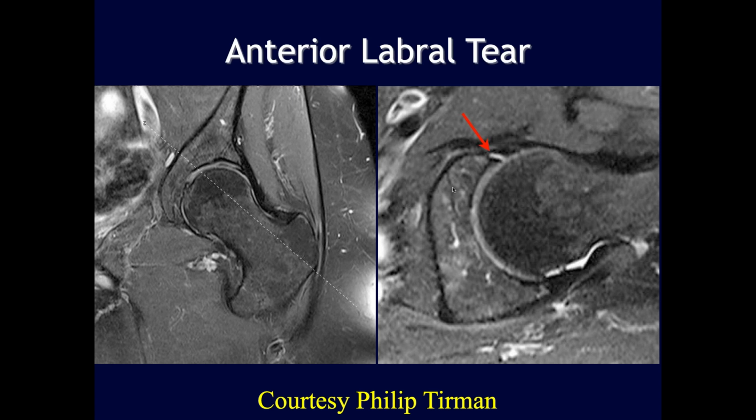This patient was arthroscoped and they actually thought that this was an actual tear. But I think that's unlikely in most situations for these kind of findings to be tears. So I agree with you.